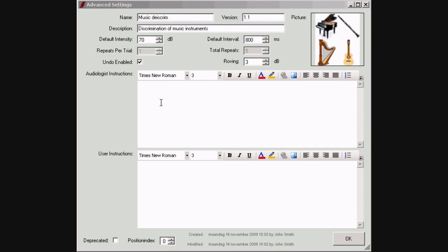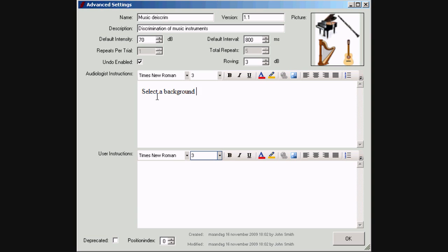Short instructions can be entered. This is a text that appears when the information button is pressed. At this moment only the instructions for the audiologist are functional.